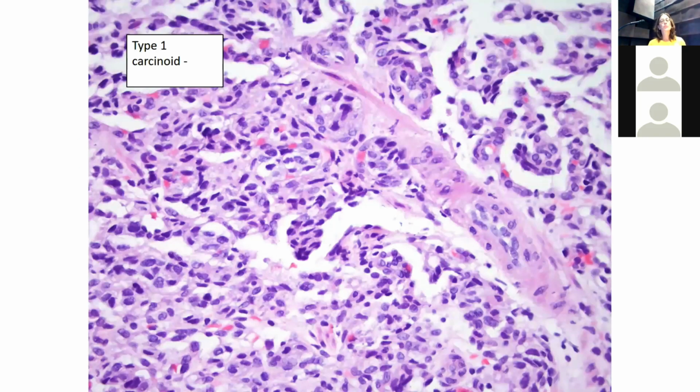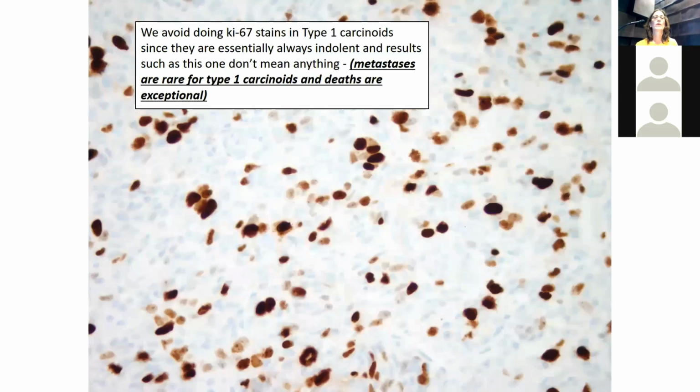All right, the trouble though with type 1 well-differentiated neuroendocrine tumors arising in hypergastrinemia from autoimmune gastritis is they can have really weird morphology. So this is one, richly vascularized, and if you're like me, you might find yourself wondering if you're dealing with some sort of a mesenchymal tumor. So you sometimes end up staining them for hand holding because you really just don't know.